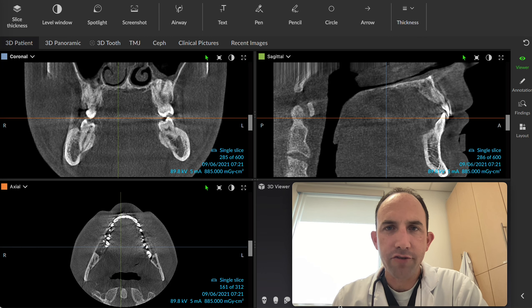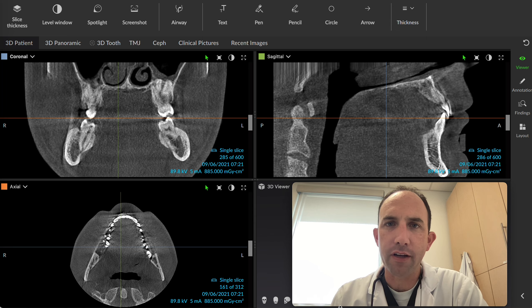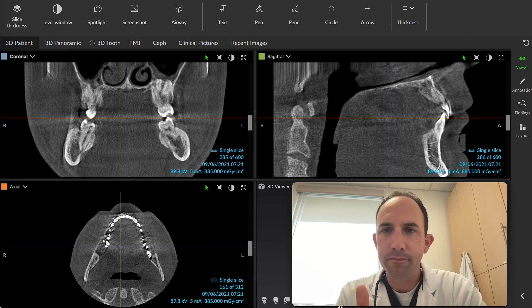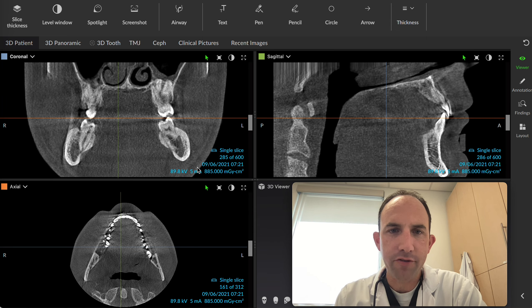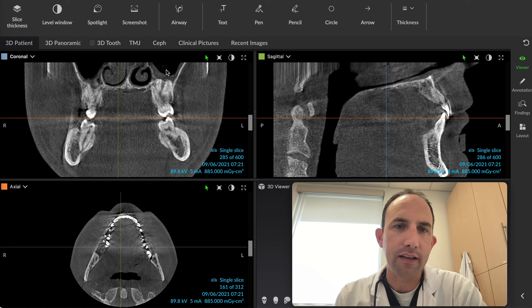Good morning, everybody. I wanted to share a really quick review of a 3D image that we took this morning on a new patient. There's one area I wanted to focus on, and that's the patient's right nasal and left maxillary sinuses.